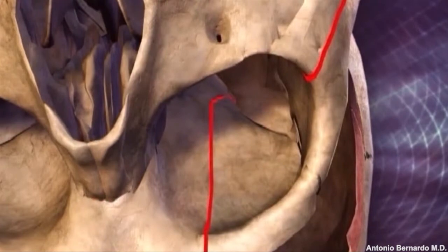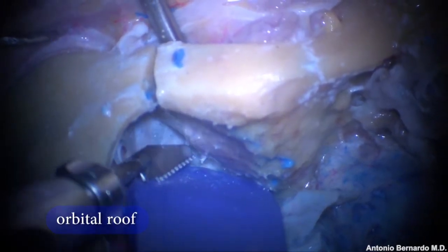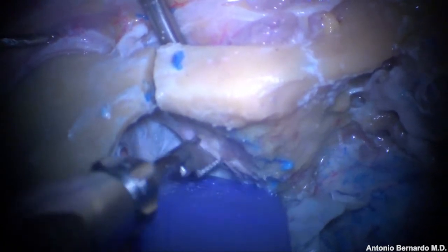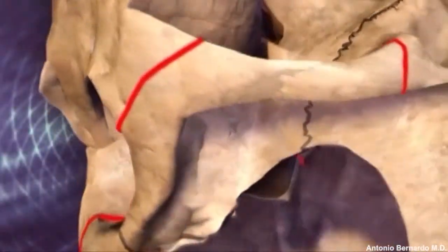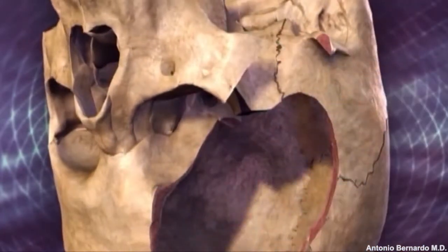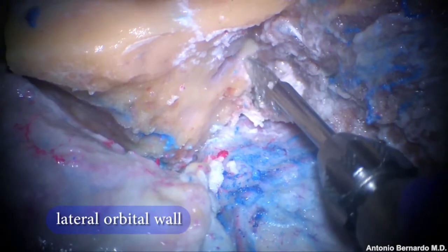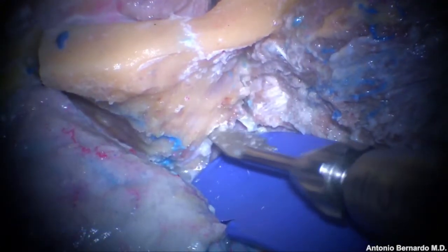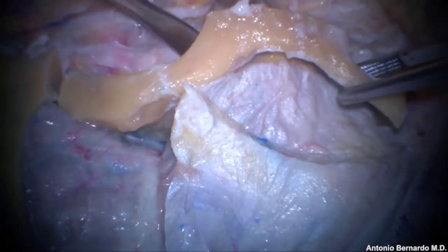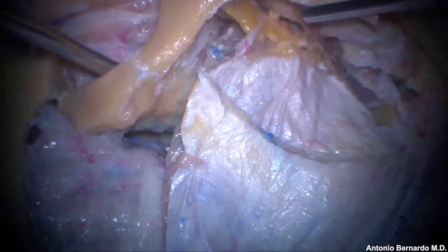The fourth cut divides the superior orbital rim and roof. The fifth cut is a short cut made from the inferior orbital fissure to the temporal fossa. The final cut is made into the lateral wall of the orbit. It is important to keep these cuts very deep in order to avoid enophthalmos after the approach. Finally, the orbito-zygomatic process is elevated.